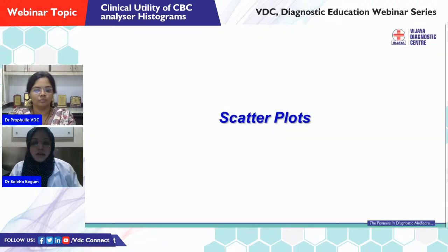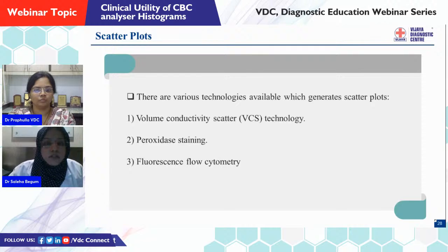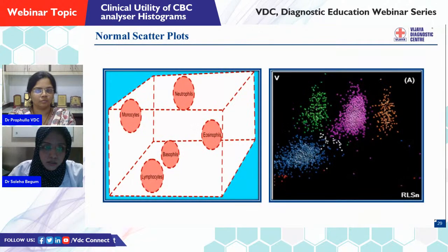So coming to scatter plots, there are various technologies available which generate scatter plots. Usually it is VCS technology, peroxidase staining or fluorescence flow cytometry. This is a scattergram showing the normal positions of different WBCs.